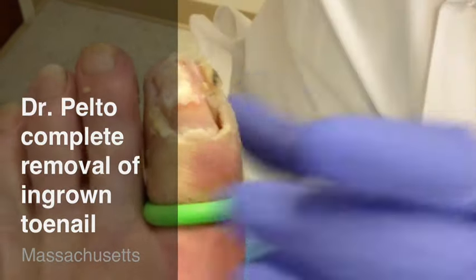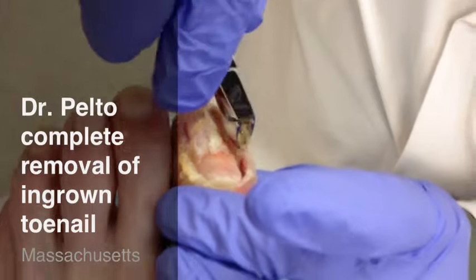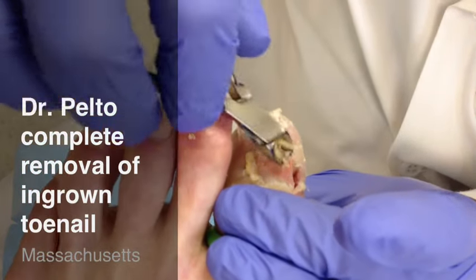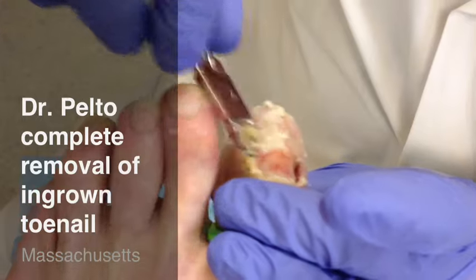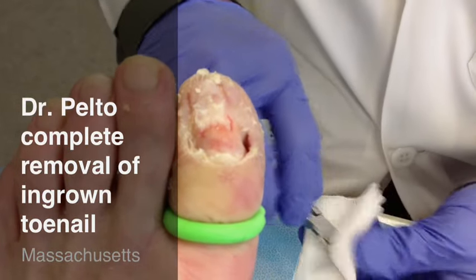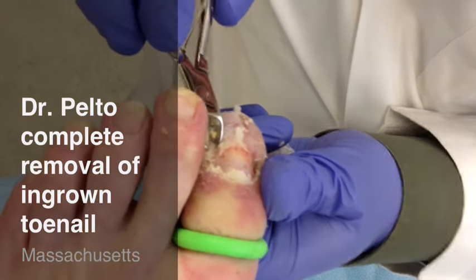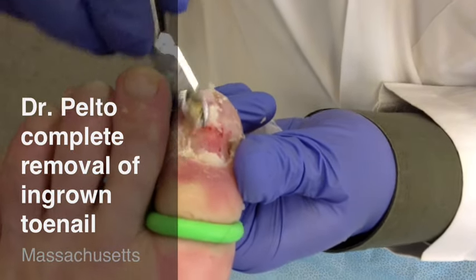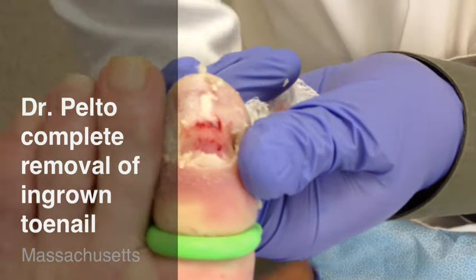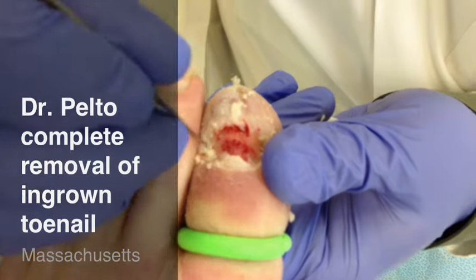Now the area around the skin, we want to remove as well — all this tissue. You see there's not much bleeding to the area because of the tourniquet. The bleeding will come back after. And this is all the tissue that's around the edge of it. You notice that in the sides of the nail there's some buildup that we want to get out. We use a little curette for that to get all this buildup out of the edges.